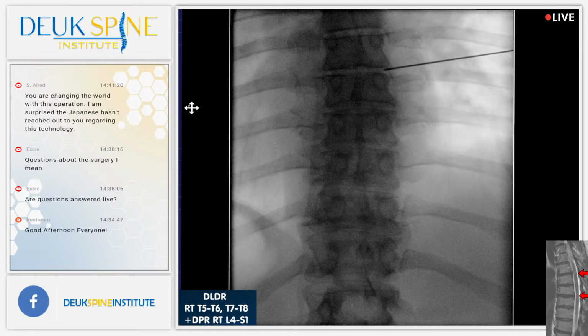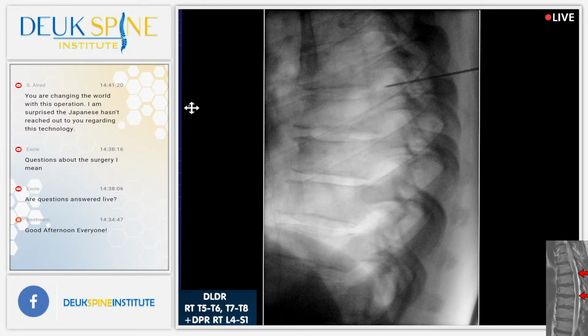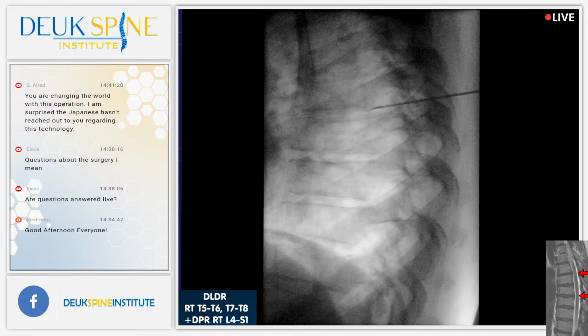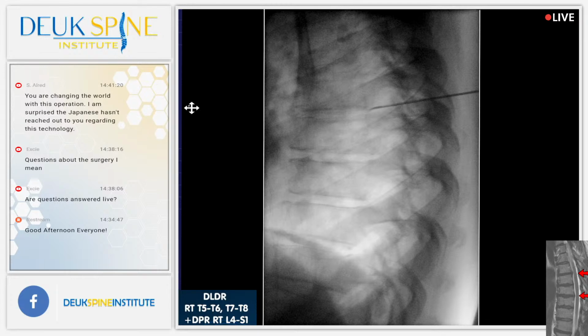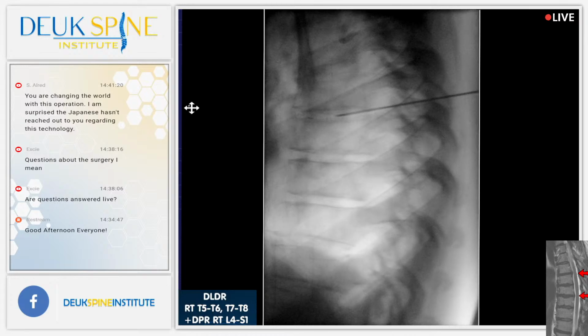Are you comfortable? I need you to echo what she says. All righty, she said yes. Where do you feel that? Where do you feel that? Right at the spot. Yeah, don't move, okay? So it's lined up perfectly. You can see I've changed the angle of my needle to head downwards, but this is really quite perfect. Sorry, it's a bit uncomfortable. But guess what? We're in our first bad disc. Great news, success. Okay?